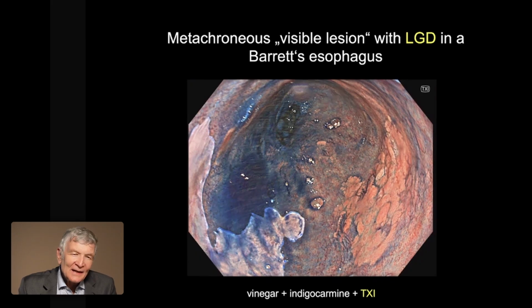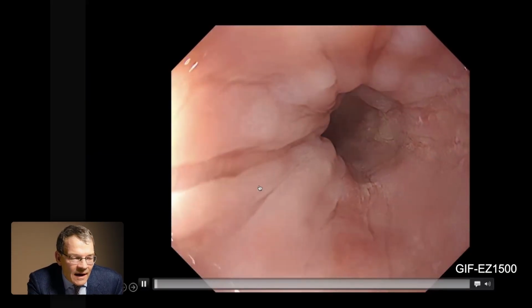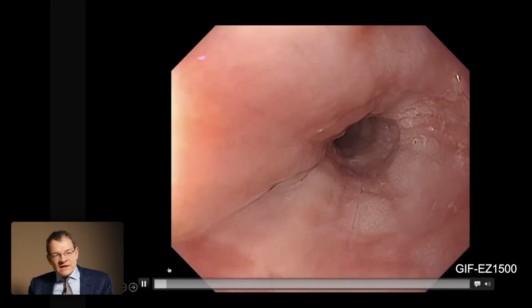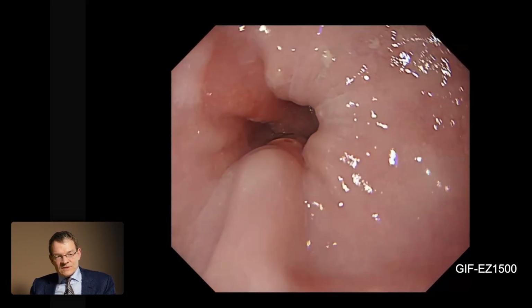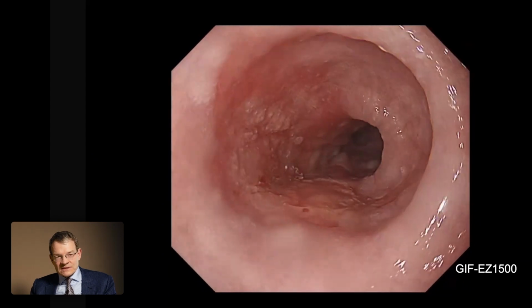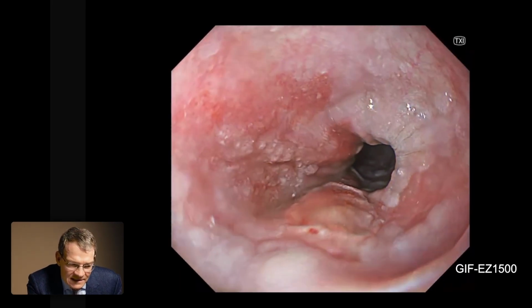Yes. Great. Stefan, you were mentioning squamous cell epithelium and lesions. Do you have examples for us as well? Yeah, for sure. So this is a patient, and she got upper GI endoscopy for abdominal pain, and finally a lesion was found here about 3-4 centimeters, 70% of the circumference, and this is the regular white light.